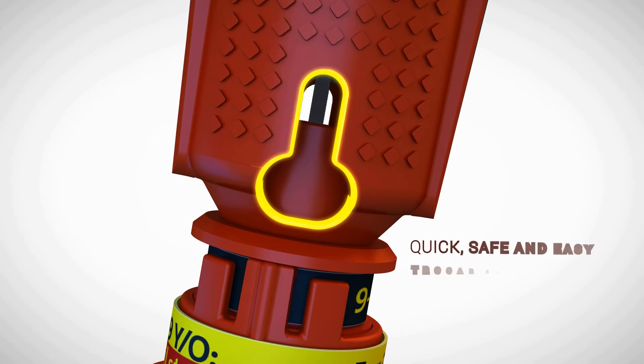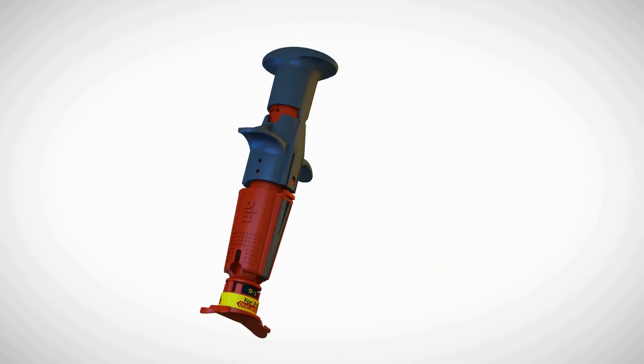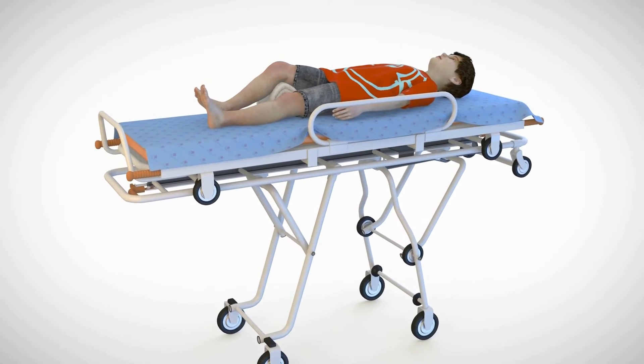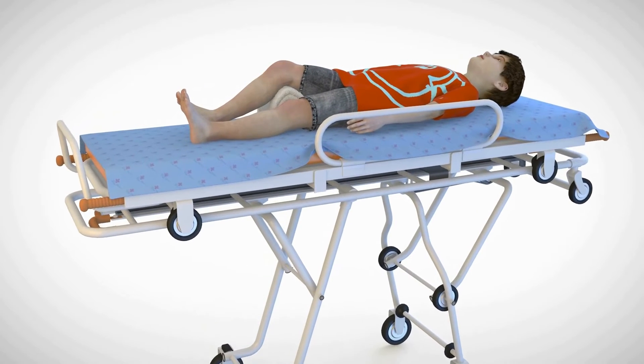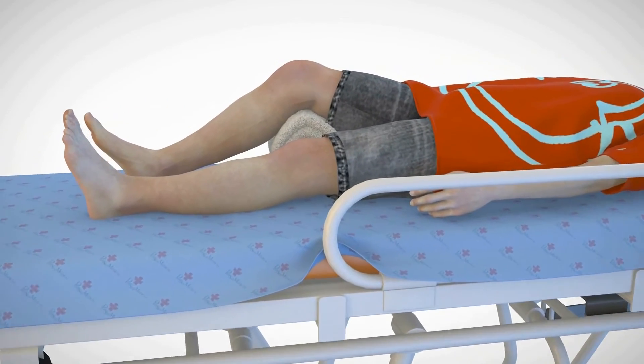The device features a trocar removal notch to assist in removing the trocar from the cannula. The NeoP is designed to provide intraosseous access in the proximal tibia. The device is intended for use in pediatric patients between ages 3 and 12 years old.